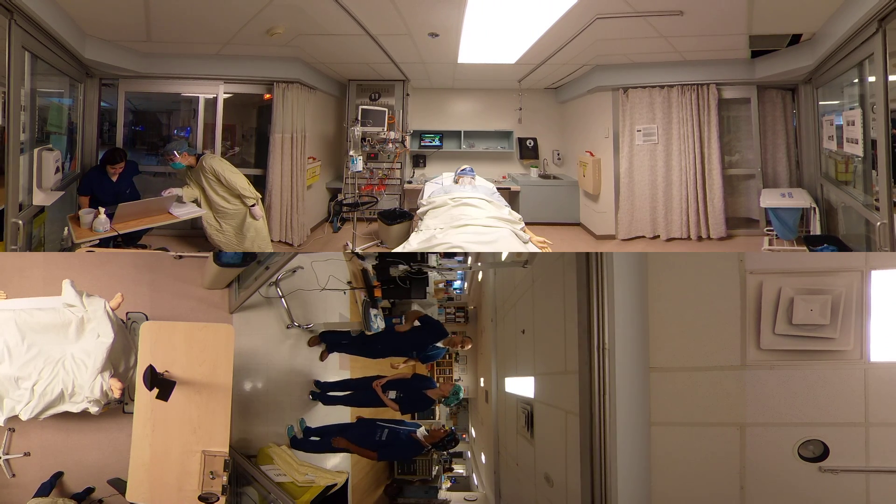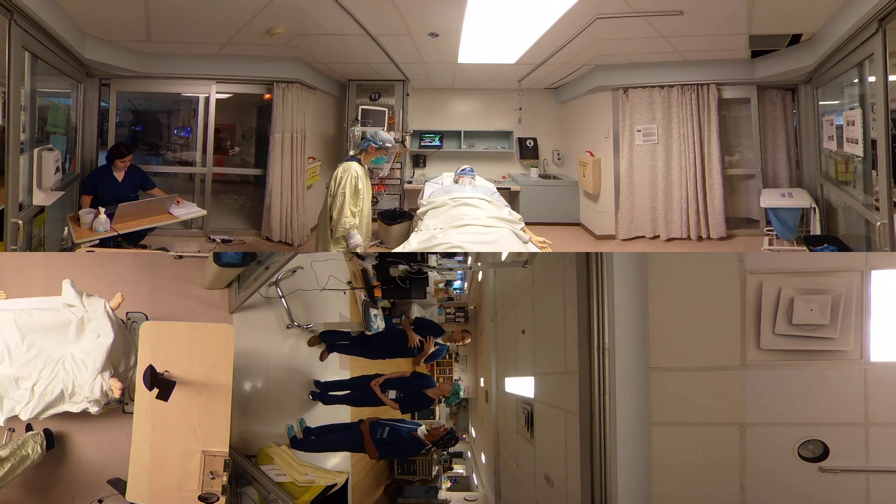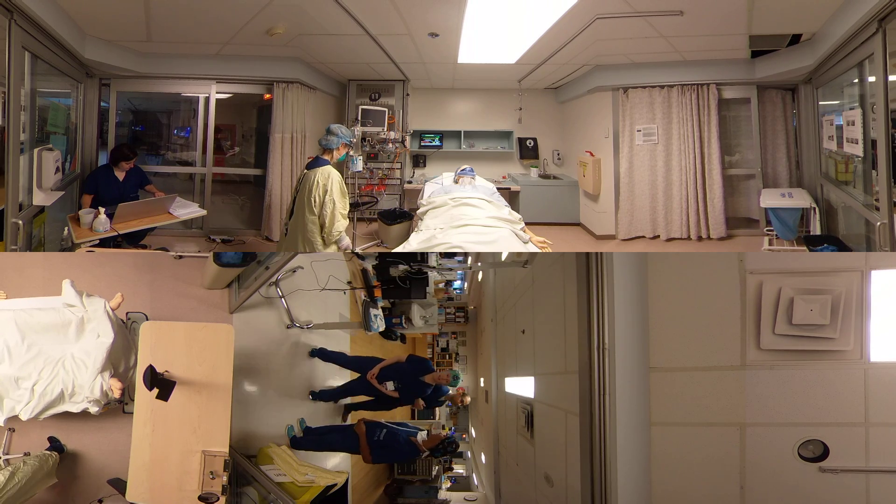I am relieved to see you. Thanks for coming. We're going to start by getting you to put on your PPE. I'm happy to read out the sign for you so that you take all the steps necessary. Thank you.